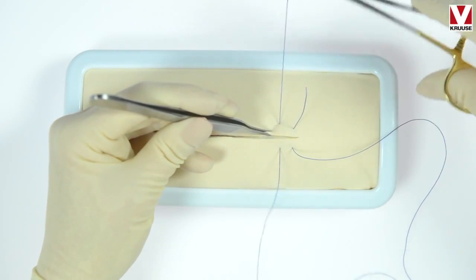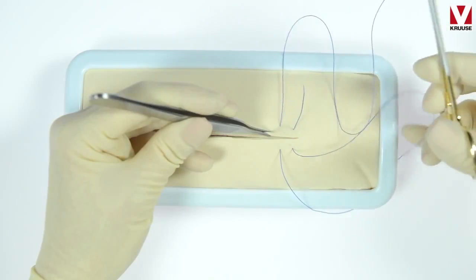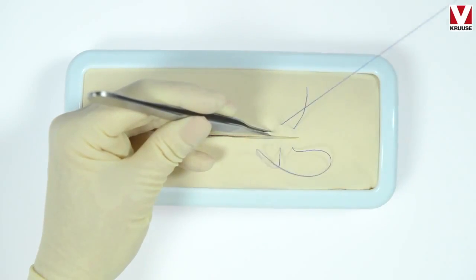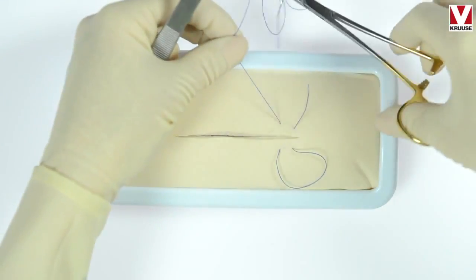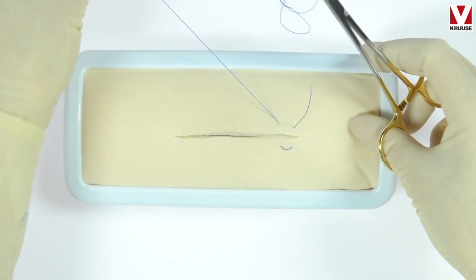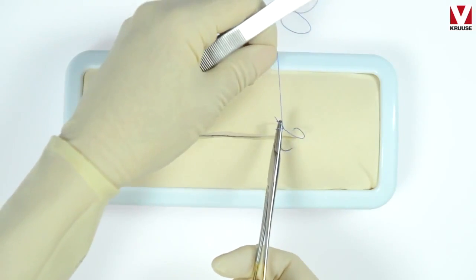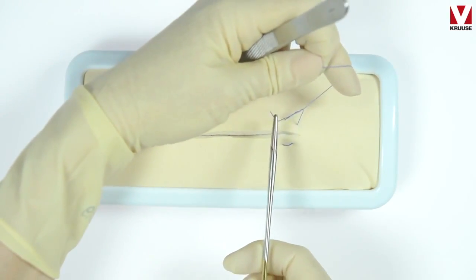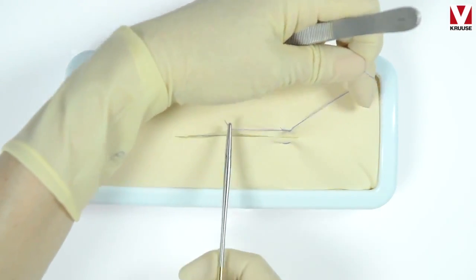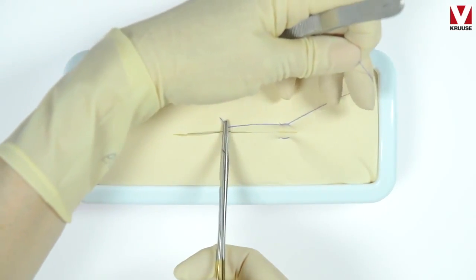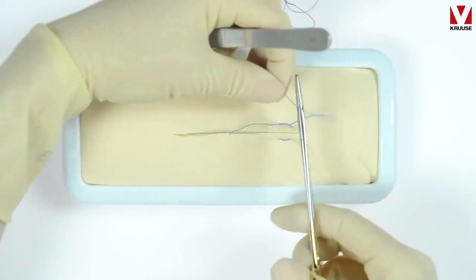So here you see the far near near pattern. Now I'm tying the suture with a surgeon knot 211. As you see here, when I tighten the suture, the suture just slips a little.